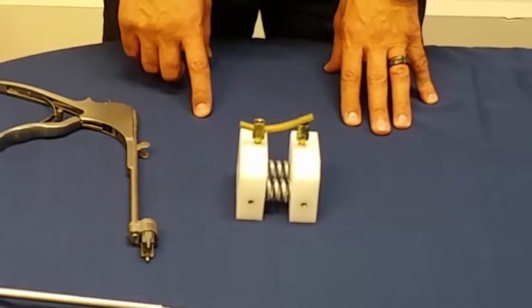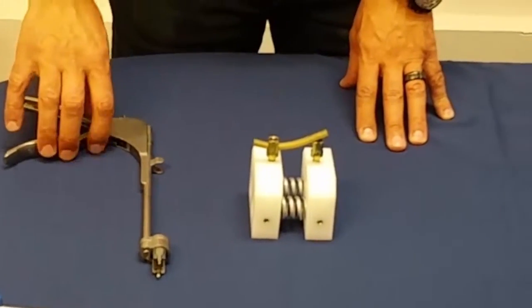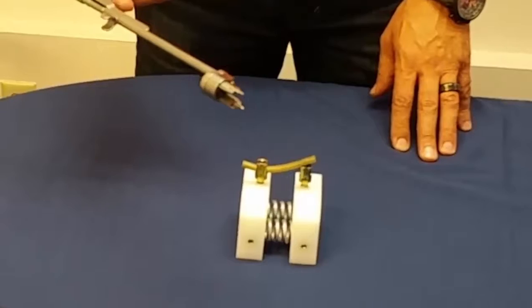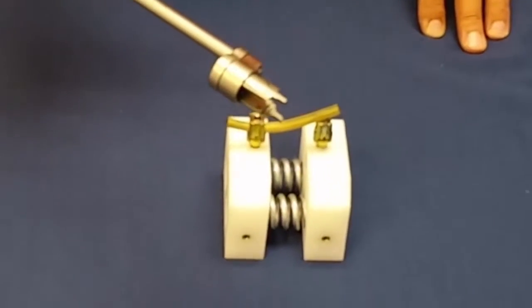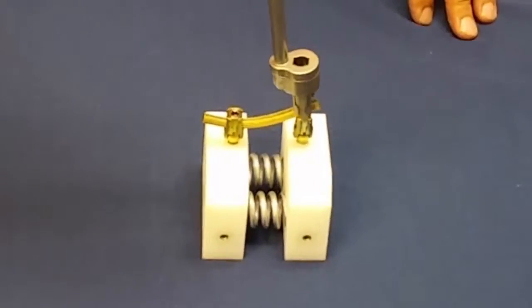The rod has been fixed on one screw and we are going to use one of several options of reduction instruments that we have to reduce the rod on the other screw.